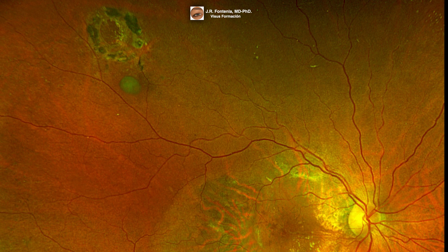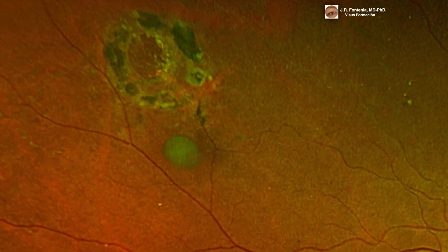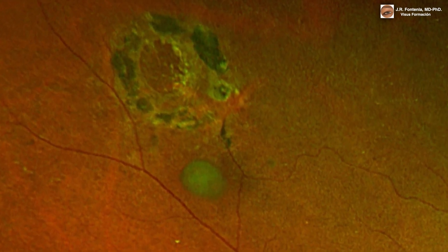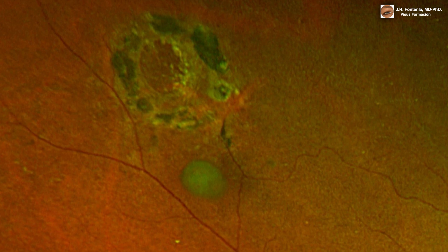Finally, this is another clinical case of retinal tears with a free-floating operculum. The laser was done a long time ago, and the periphery of the retinal hole shows the typical appearance of a retinal scar.